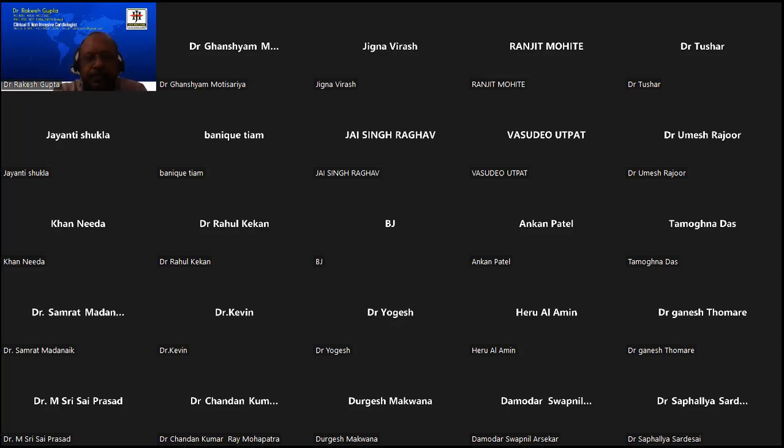And for LV hypertrophy, do we need to take a direct measurement of septal IVS and posterior wall, or do we need to consider an index value, sir? No, we don't have an index for these dimensions. We have LV mass only indexed, like various views are there. The American Society of Echo says more than 10 millimeters. And if we consider 10 millimeters, almost everybody in India is hypertrophic.